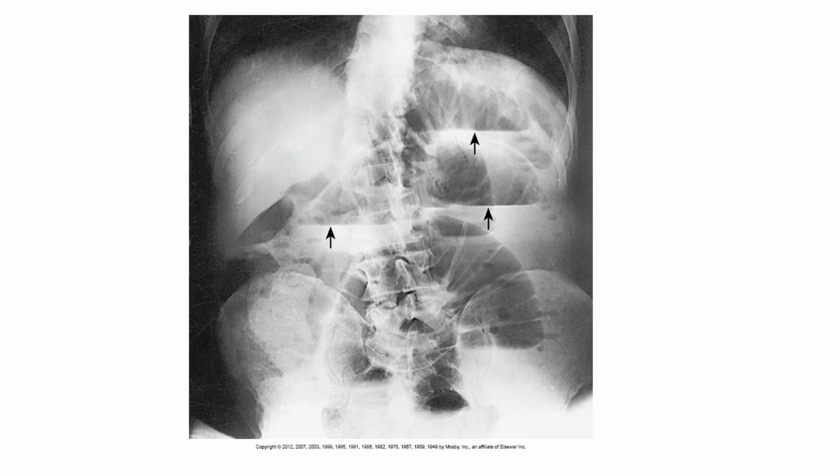Okay? On a radiograph, the air fluid boundary also shows up with an X-ray flashlight. So in chemistry, you're reading the refraction of the light coming off the meniscus. That's how you can identify that meniscus. Well, you can see the air fluid boundary with X-ray light too, inside a patient.